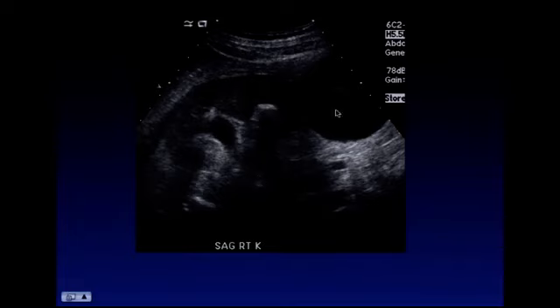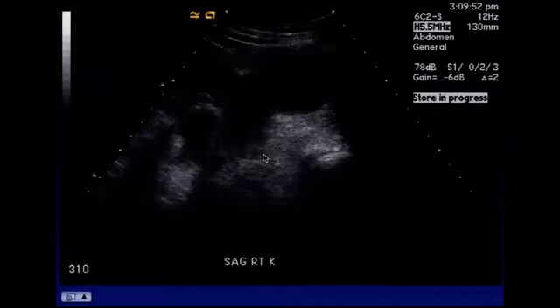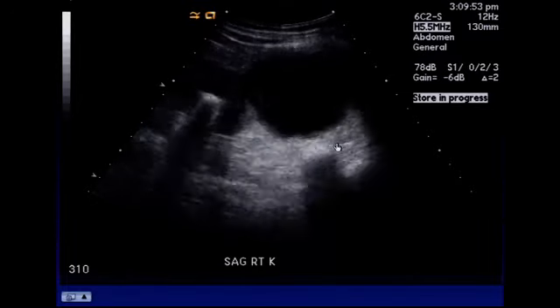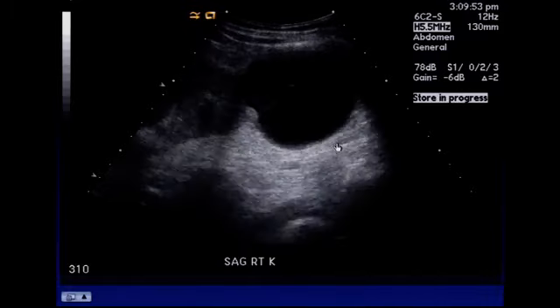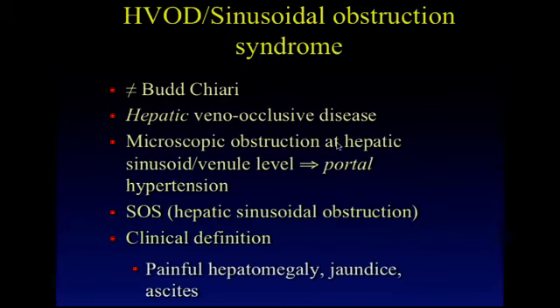But the real cause of his pain is this exophytic cyst that has now developed a hemorrhage. When we turn transversely on it, we see this kind of amorphous, low-density, non-vascular, dependent clot. And here, as we sweep through it on this clip, it's got the very typical geographic shape of hemorrhage. So this, again, is a known complication of this drug.